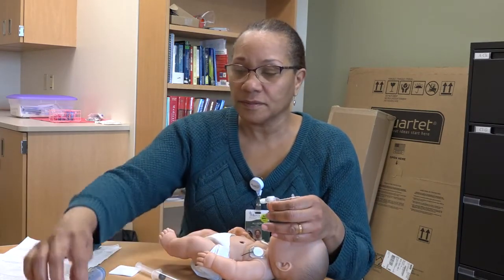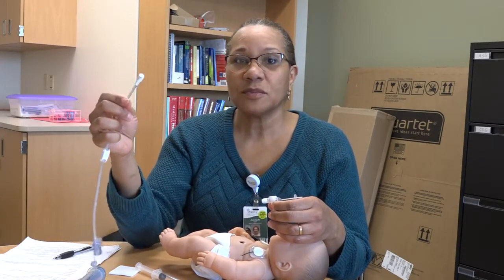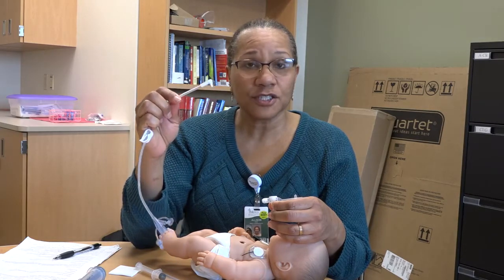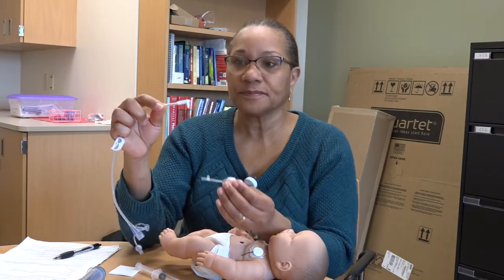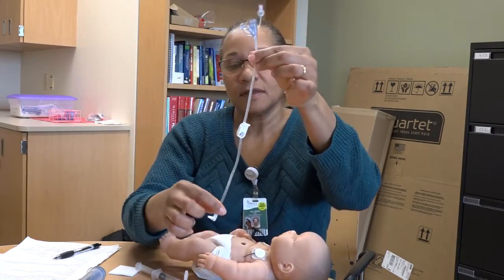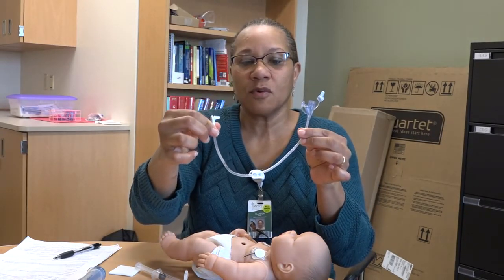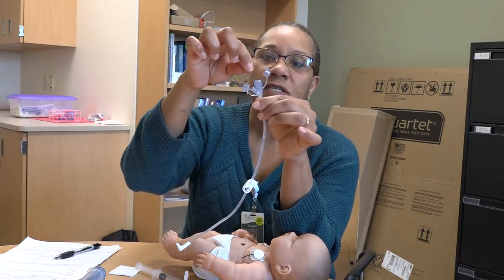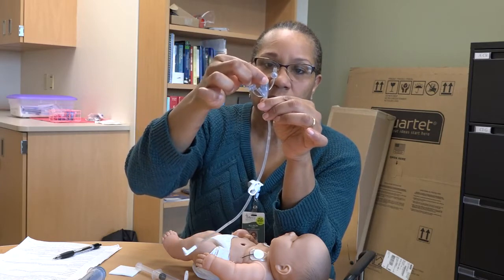Now, when you feed your baby with the G-tube, there is going to be a feeding extension tubing that you will put into the G-tube. So this is the feeding extension tubing. This is the feeding port. It's a 90-degree secure lock port. This is the feeding port that you would attach the actual feeding tube to.